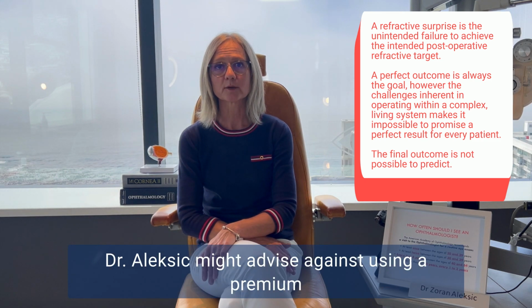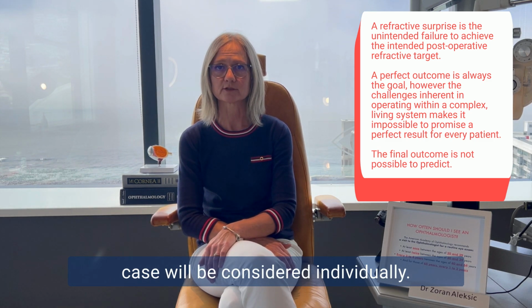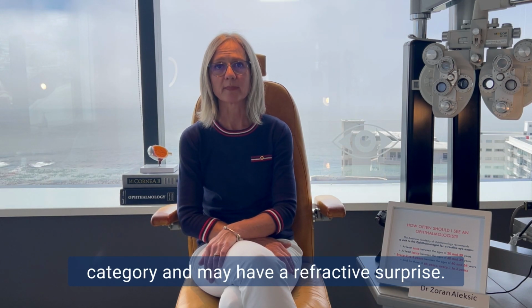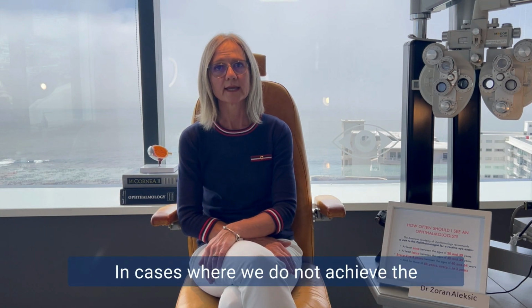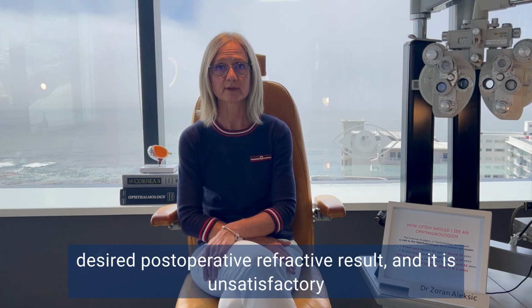Dr. Aleksic might advise against using a premium intraocular lens in these cases, but each case will be considered individually. People with high refractive errors or very steep or very flat corneas also fall into this category and may have a refractive surprise. If we find that you fall into this category, it will be discussed with you in more detail.